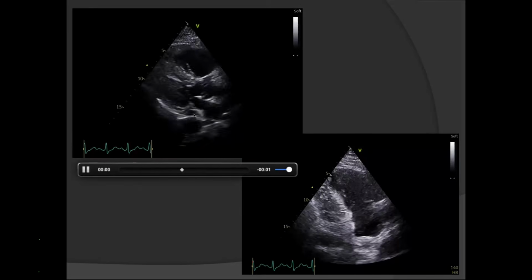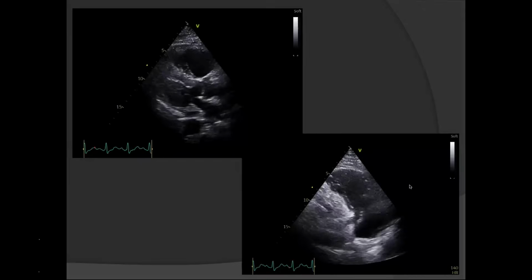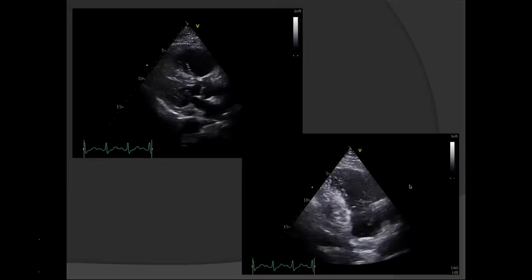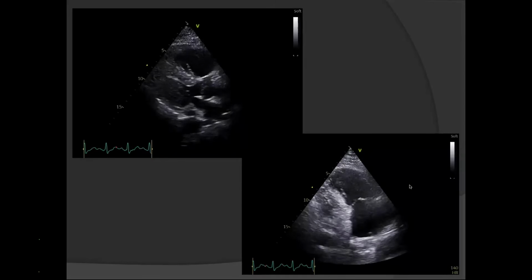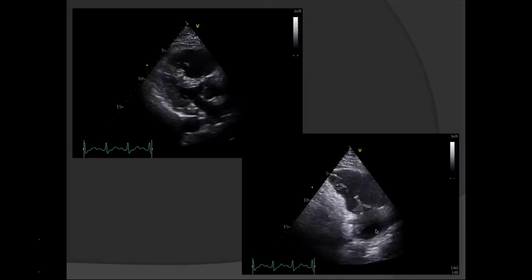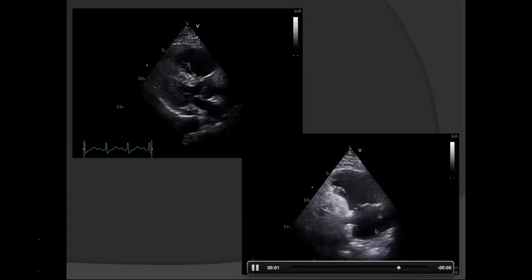The patient had been given pre-op clearance based on a normal study. But RV inflow view, anybody diagnosis quickly? Isn't the RA showing an embolus in the inflow view? Yes, a thrombus in transit. Pulmonary embolism. This earthworm-like structure moving around in RA. So this is thrombus in transit.